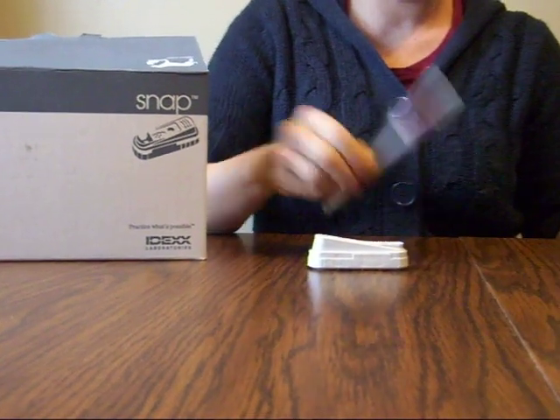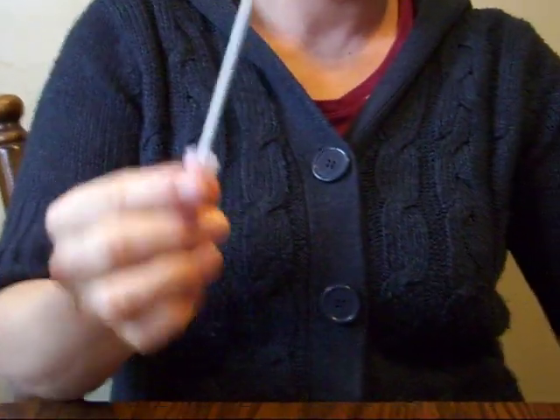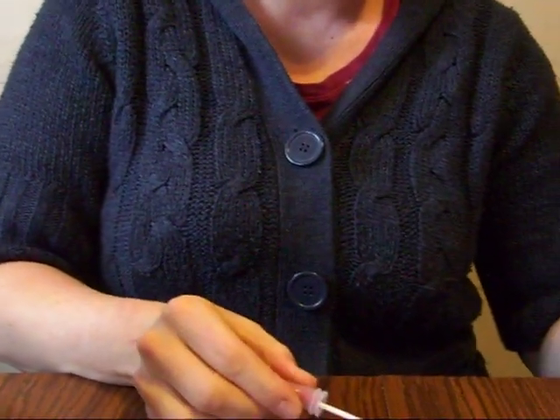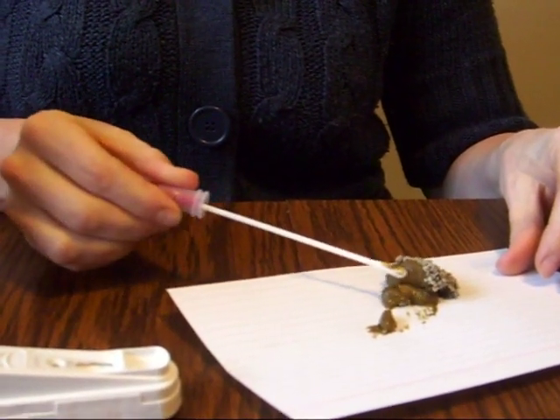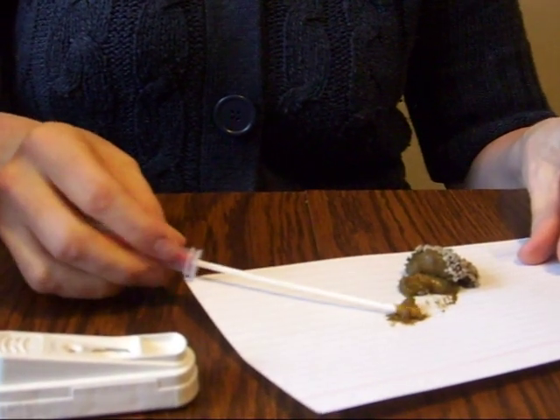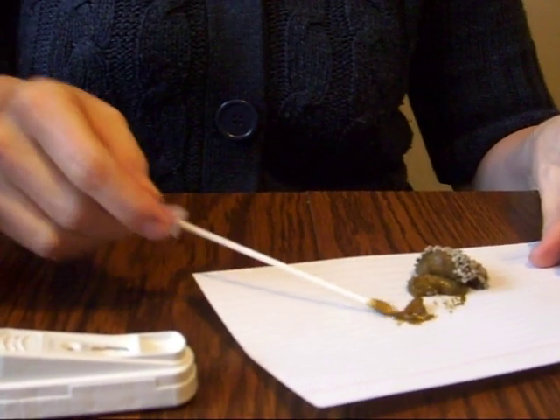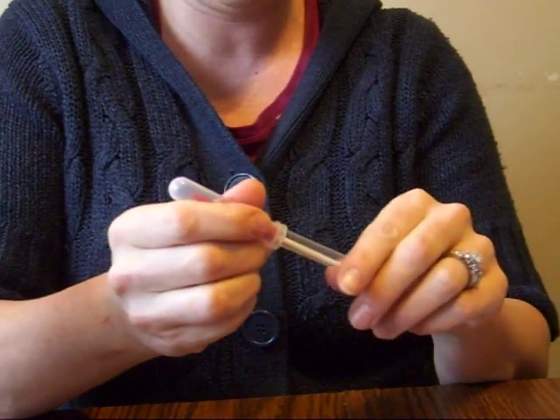These can be a little tricky, so I'm going to explain how we do this. First, you grab the middle and separate it so you have a Q-tip. Then you have to roll the Q-tip into your stool sample — try to find different areas of it. You don't want too much stool on there, just enough. Now, slowly slip it back into the test tube.